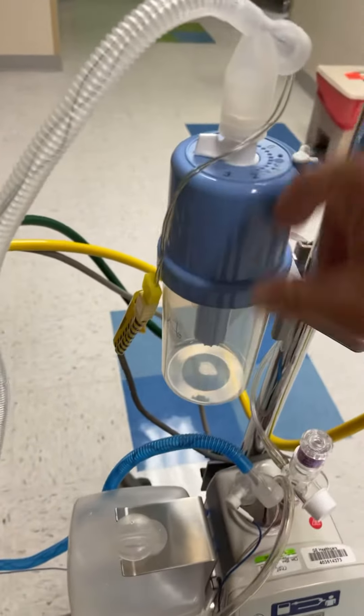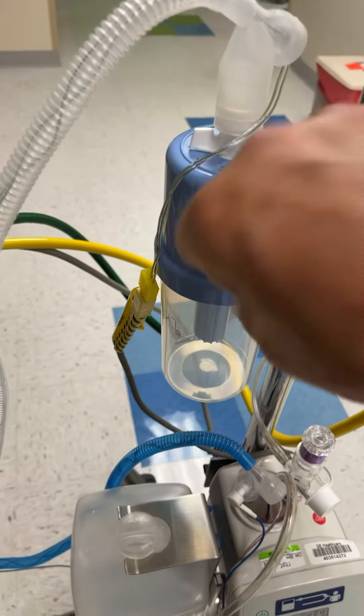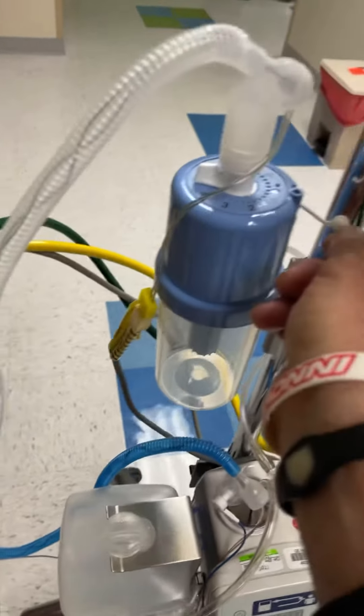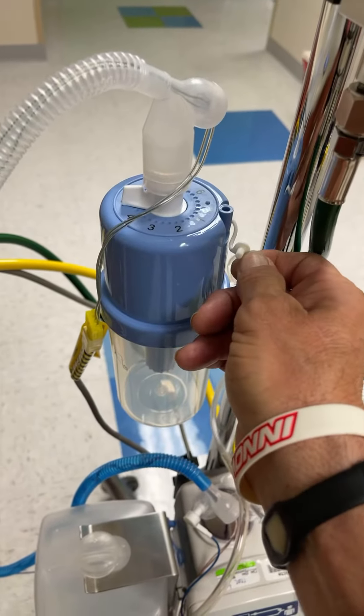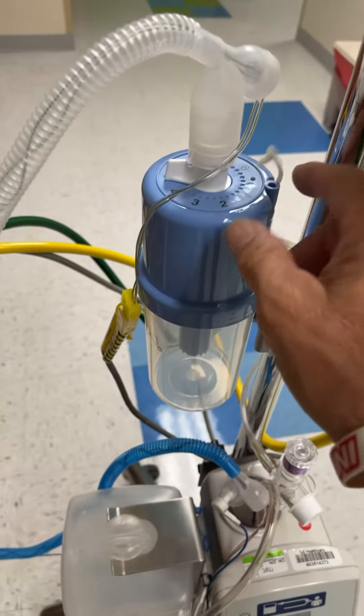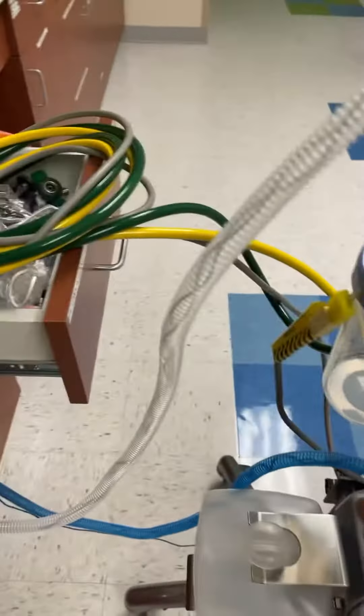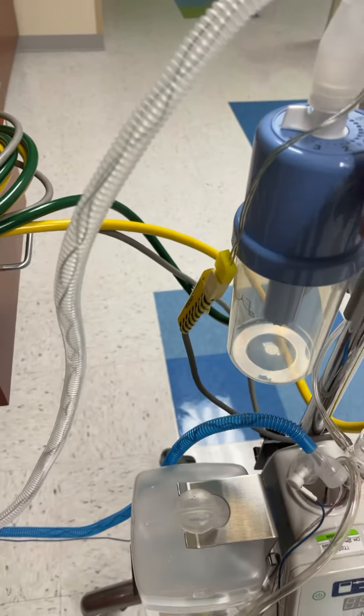You can unscrew this — it will come off and then just pour it in there, or you could fill it through this little port. Sometimes it gets too much water and you have to suck it out with a luer tip 60 ml syringe. Just pull it out through here and it'll make the level go back down to where it should be.